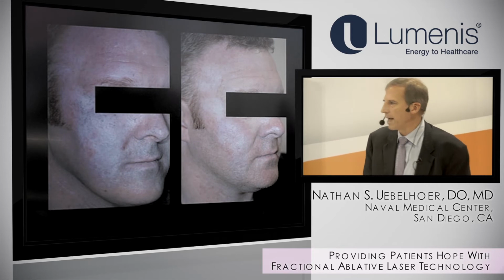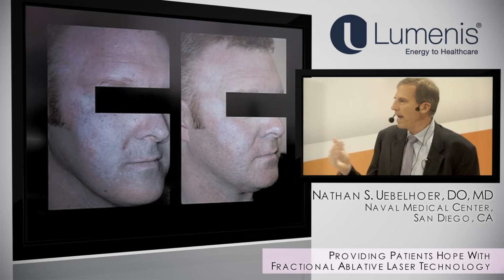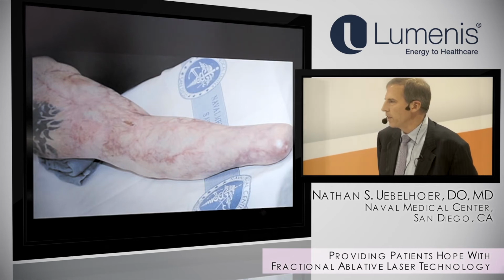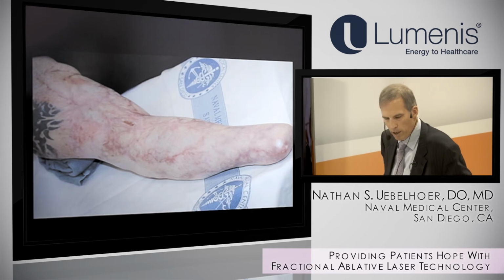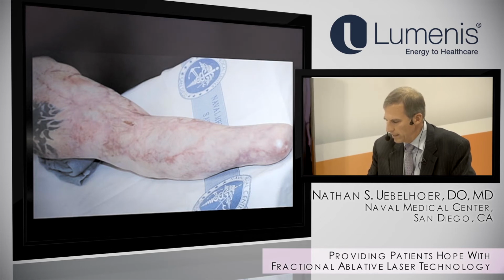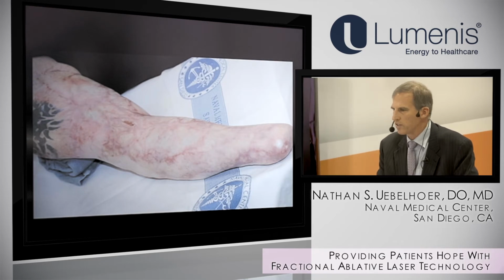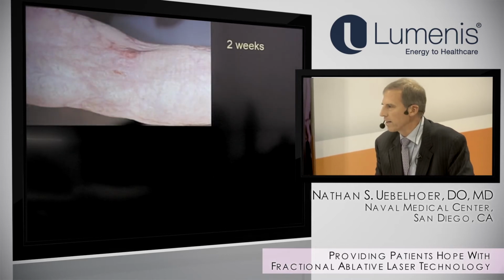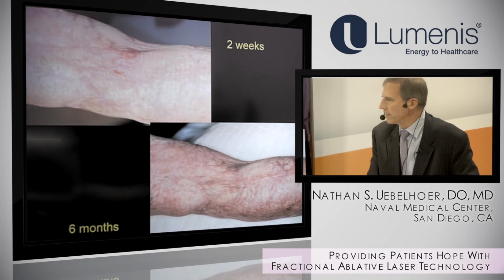Here's another patient that we treated back in 2001, 2002 for tattooing of his face from a blast injury. Then he came back years later to get some more treatment of the face, and we noticed that he still had this ulceration on his limb that had been injured in the bomb blast. We went ahead and treated that spot again. This is now 2010, and we had last treated him in about 2003 or so. So you're talking about 7 years of dealing with this erosion coming back and forth and back and forth. We treated him, and 2 weeks later it had healed up. 6 months later, it was still healed. We treated him a couple more times, and he continued to have improvements.